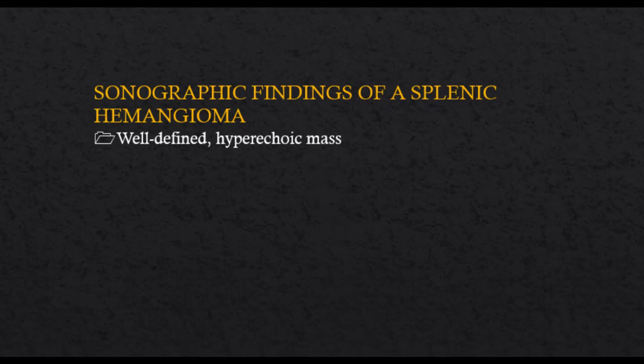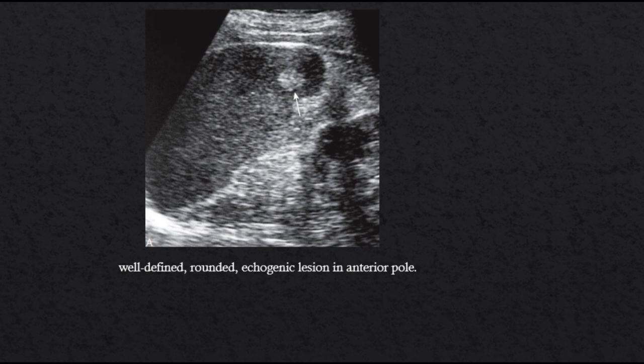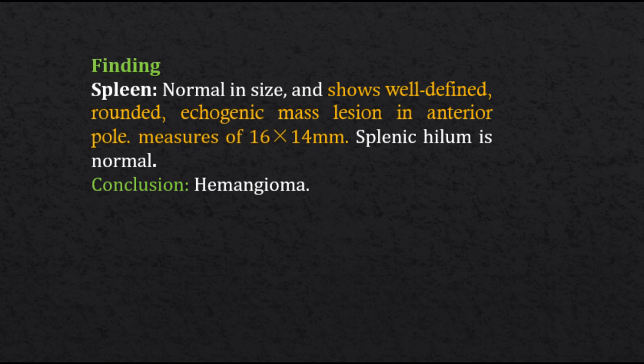Sonographic findings of a splenic hemangioma: well-defined hyperechoic mass; well-defined rounded echogenic lesion in the anterior pole. Case finding: spleen normal in size and shows a well-defined rounded echogenic mass lesion in the anterior pole, measuring 16 by 14 mm.